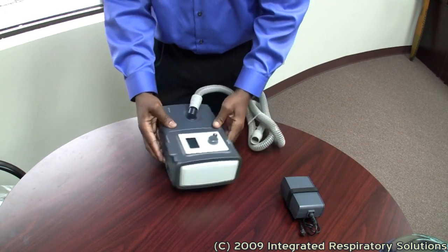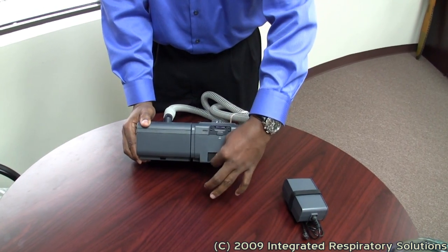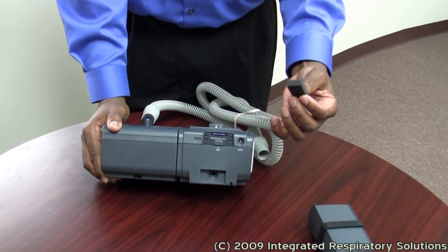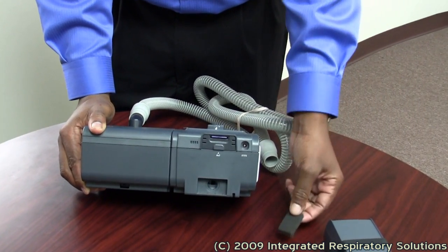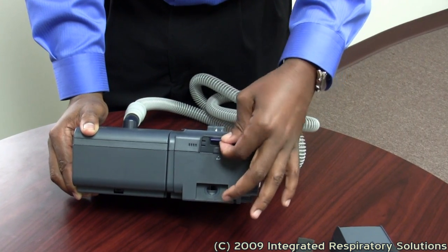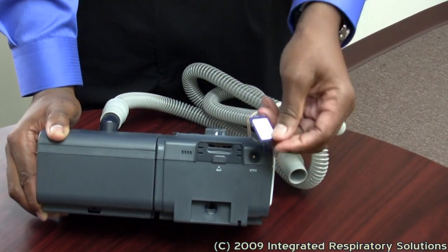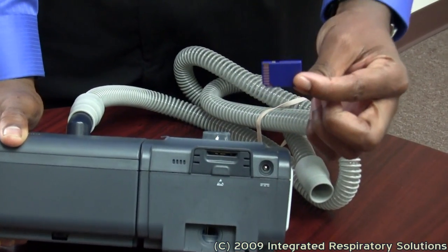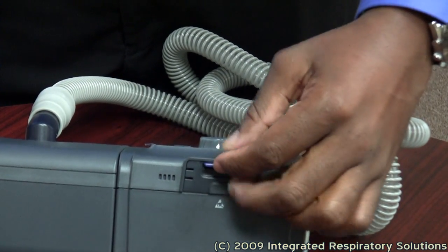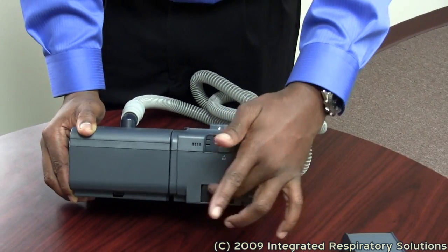On the back of the device, filters are right here. This is a pollen filter. Most CPAP or BiPAP devices will come with this piece. There is also an SD card, which records compliance information while you sleep. This is the piece your doctor will need when you come in for your follow-up. The SD card goes in just like that, and your pollen filter goes in just like that.